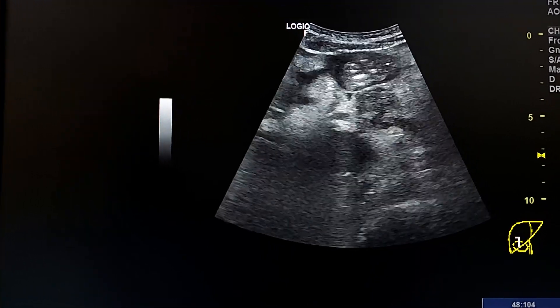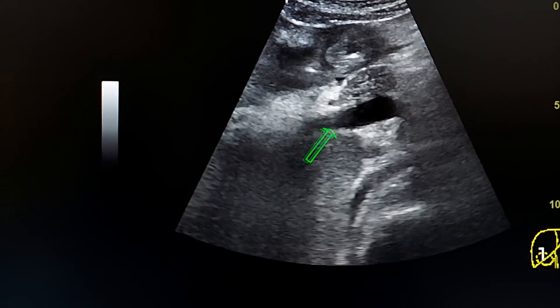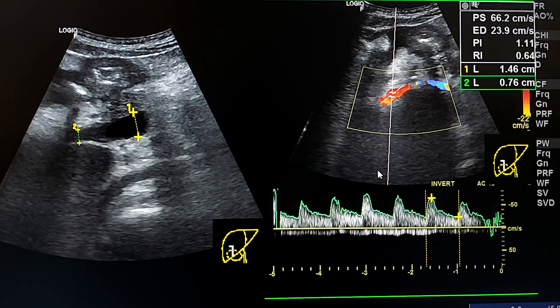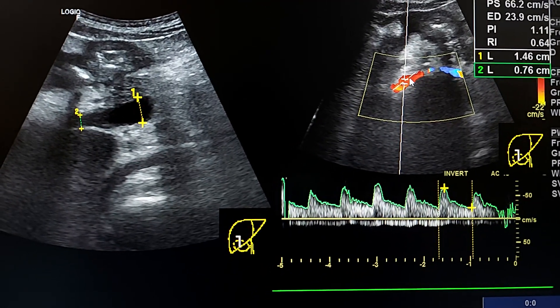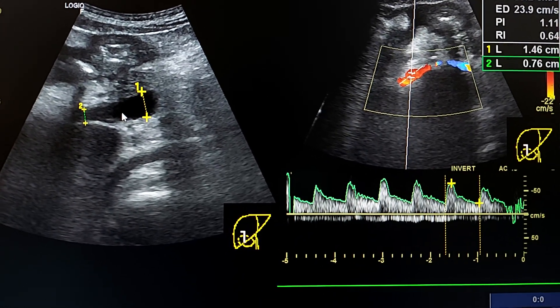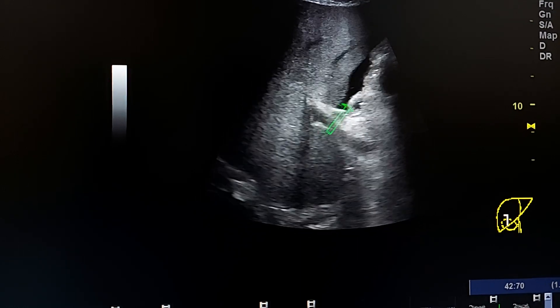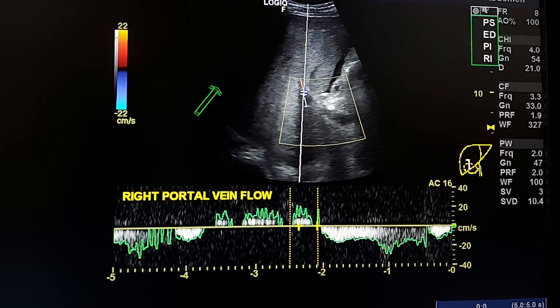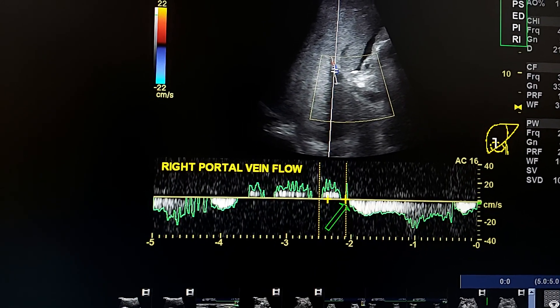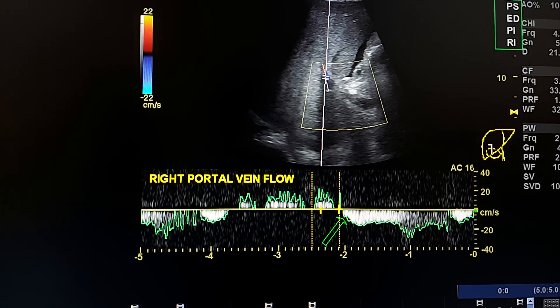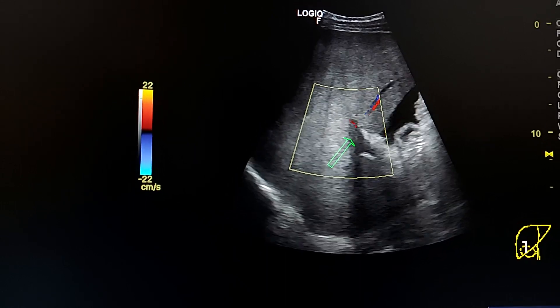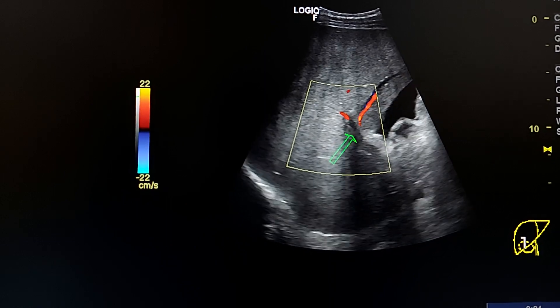This is the portal vein, which appears abnormal and narrowed here. This is the pancreas, which is normal. Spectral Doppler analysis of the hepatic artery, and here is the portal vein. During spectral Doppler analysis of the portal vein, we see hepatofugal flow, confirmed here by color Doppler in blue color.